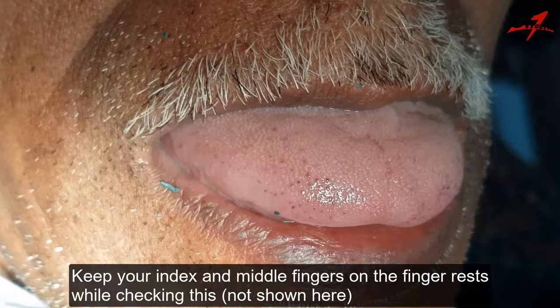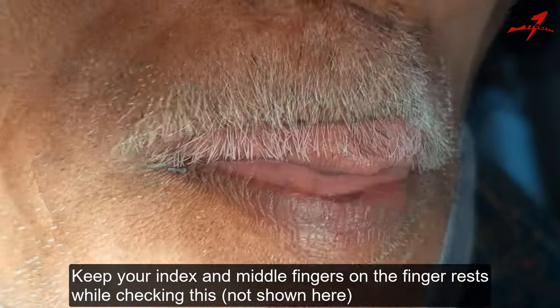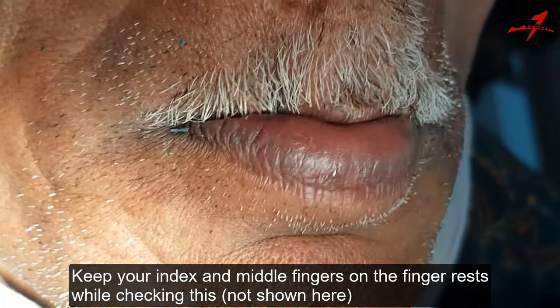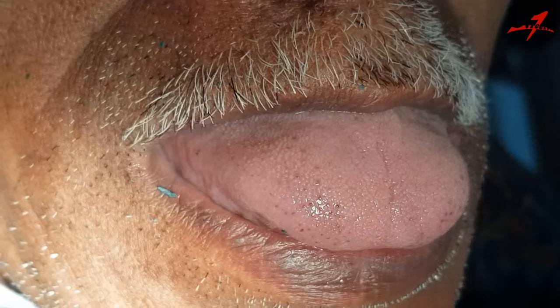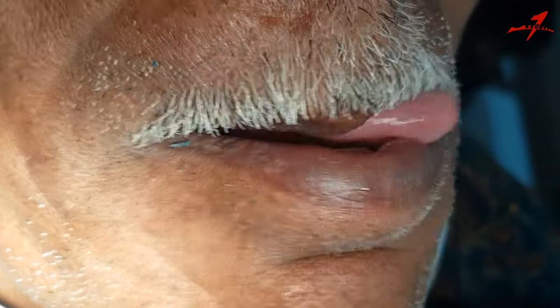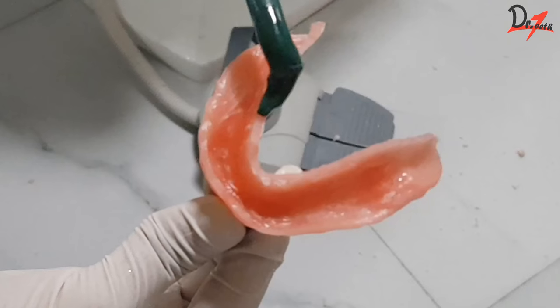Ask the patient to protrude the tongue and put the tongue on the left side and right side. If the tray is lifting on doing any such movement, it means the tray is overextended and you have to reduce it. So don't neglect this step, otherwise you might not get retention at all. Now we will start the border molding from the distolingual area.